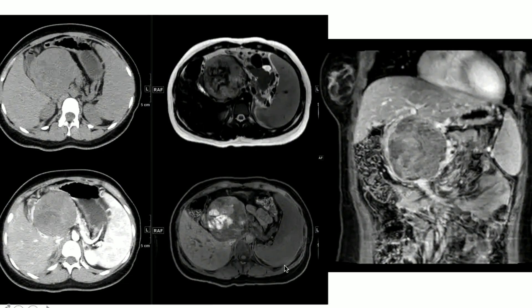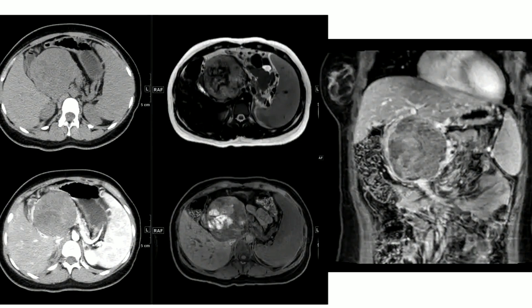To differentiate T2 from T1 on MRI, I look at the CSF in the spinal canal — if CSF is bright, it is T2; here, the CSF surrounding the spinal cord is low signal, so this is T1. Therefore, this lesion is iso-intense on T1 and hypointense on T2, with internal cystic areas that are high on T1 and low on T2, signifying signals of hemorrhage.